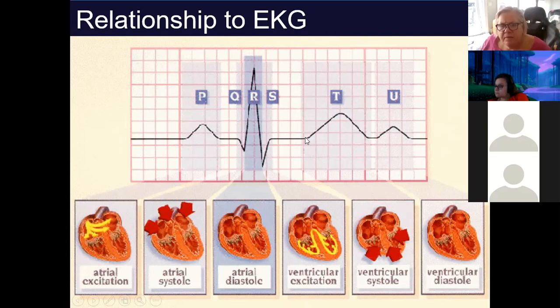Then again, there's time in between, and you have a T wave, which represents ventricular systole or ventricular contraction. Now here, this is a lead 2 of a 12 lead EKG, and you see the P wave is upright and the T wave is upright. This is a pearl: in a normal EKG, your P waves and your T waves should always go in the same direction.